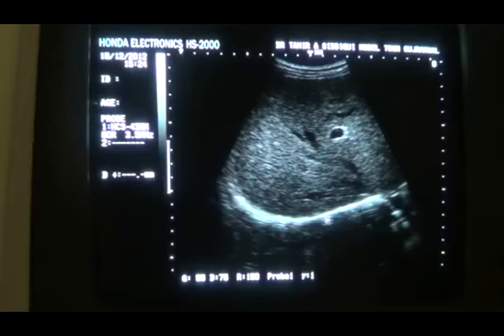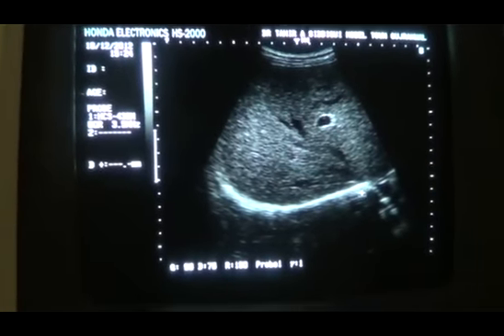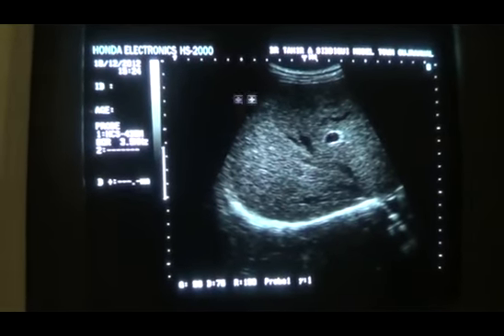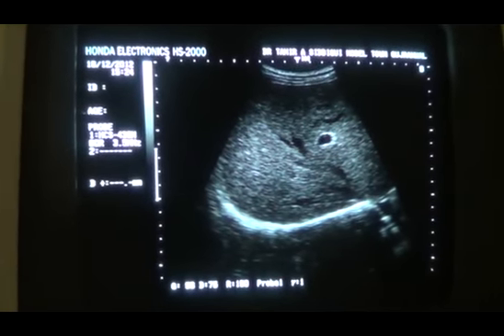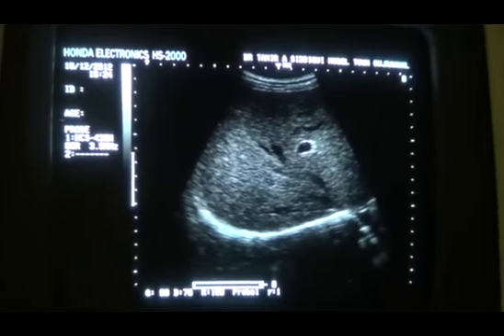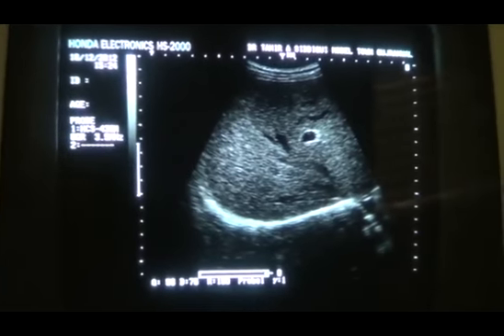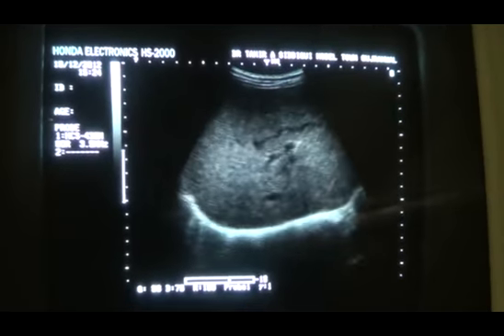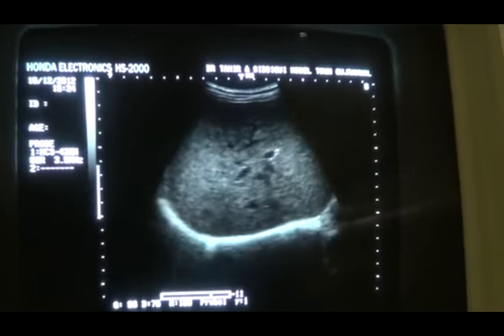This is the right hemidiaphragm. This will be the normal diaphragmatic echo brightness and thickness, and the liver echogenicity will be the same throughout. So this is a study of a normal liver, because until and unless we are well acquainted with what a normal liver looks like, we will not be able to differentiate the pathological liver. Thank you.